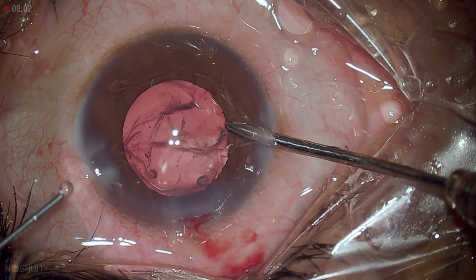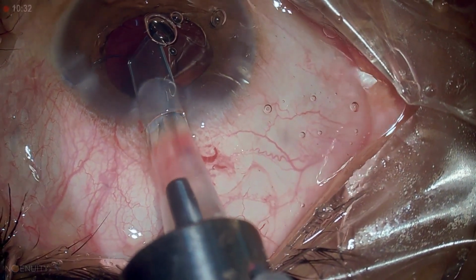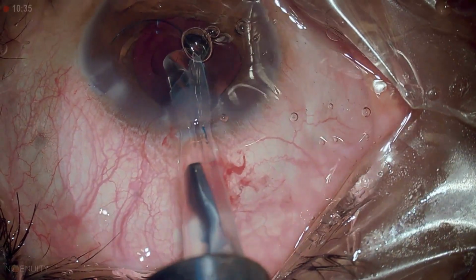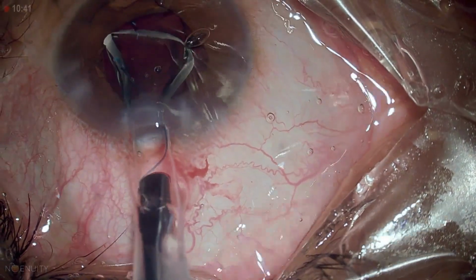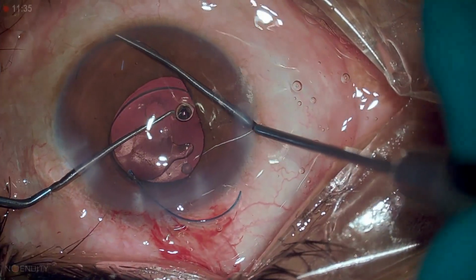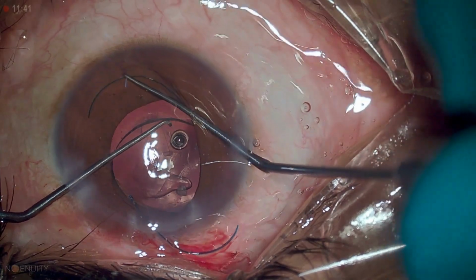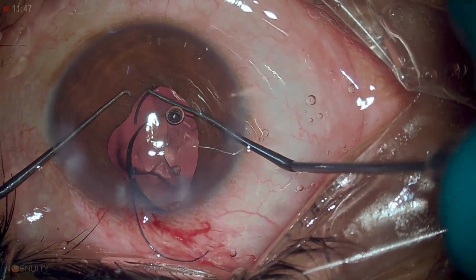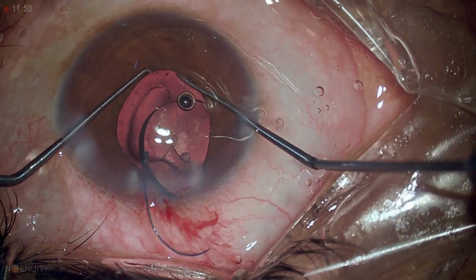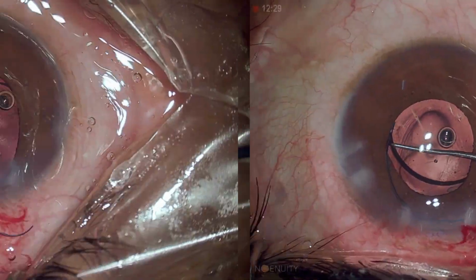Here the choice of IOL would be a 3-piece IOL, and I would try to put it inside the bag as well. The rhexis is intact, so definitely I'm going to try to put it in the bag, and I am able to do it with a bimanual maneuver. So that's the leading haptic going inside the bag, and then you dial the rest of the lens in the bag slowly.